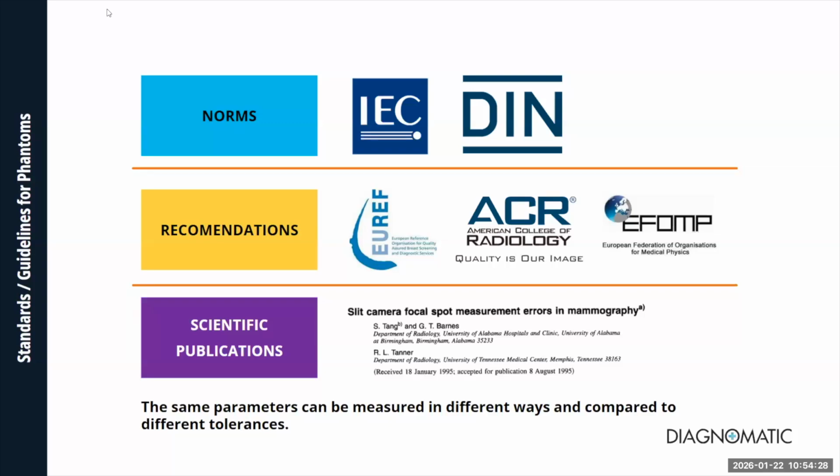So not only norms, not only recommendations or guidelines, but also task groups and publications are the base to design and deliver test tools that serve to measure different parameters and can be used to compare the same in different ways and different tolerances.